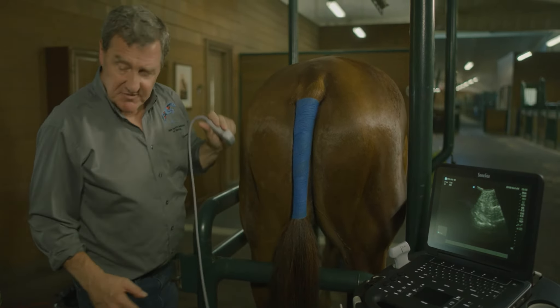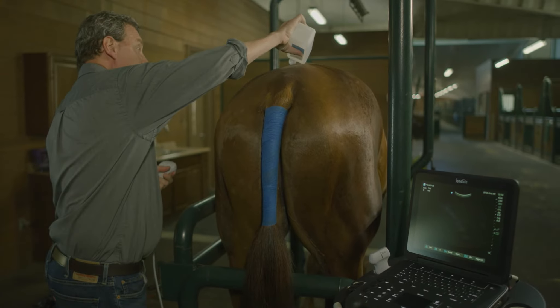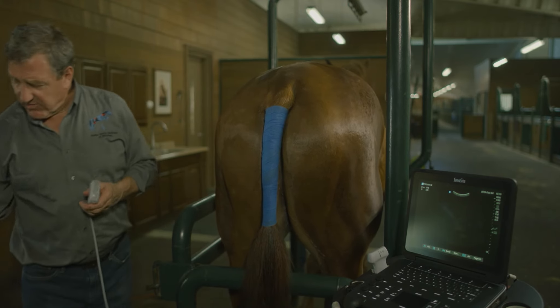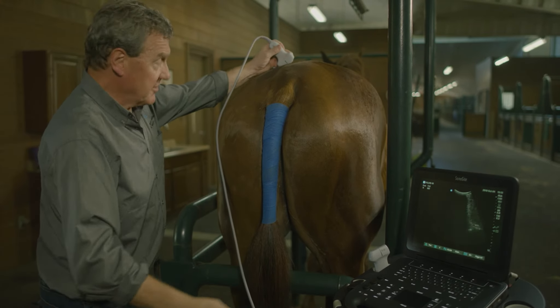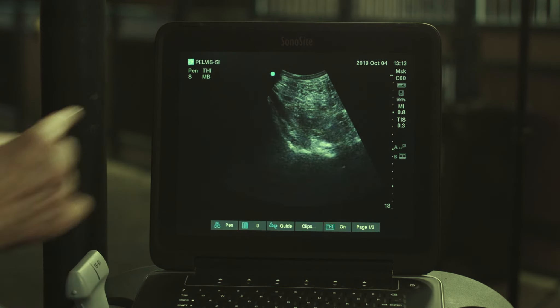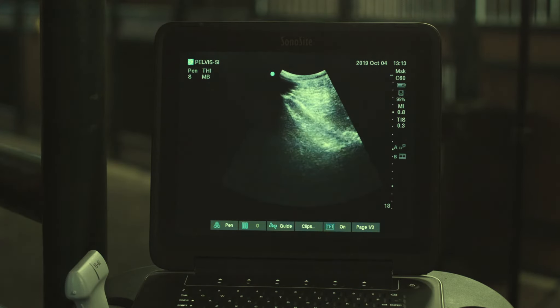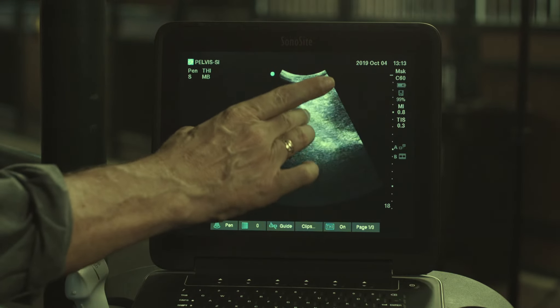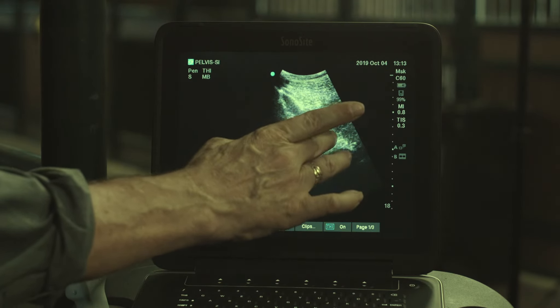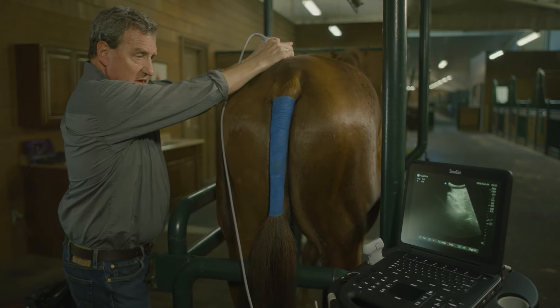The other thing I'd like to show, from the side — after dousing again with alcohol and unfreezing the image — is that you can actually evaluate the side of the sacrum. Moving off the injection landmark, there's the ilium, there's the sacroiliac region. With the gain turned up you can see the side of the sacrum. By tilting the probe down you can evaluate this whole area of bone — this area is the sacral caudalis muscle within the confine of the membranous portion of the dorsal sacroiliac ligament. Sliding back, you can look at the entire sacrum and the sacral caudalis muscle.